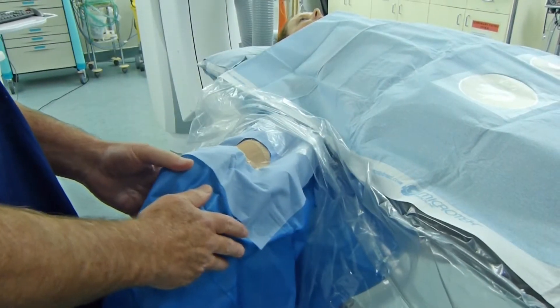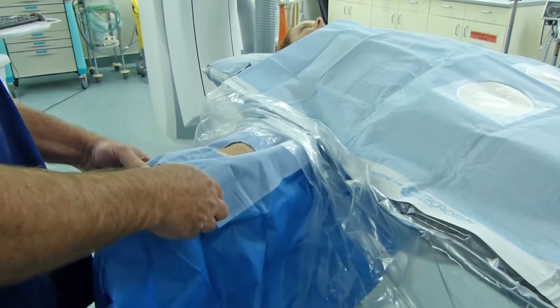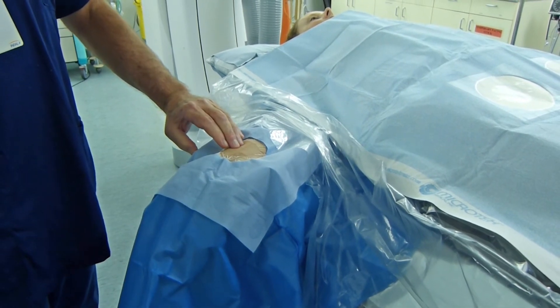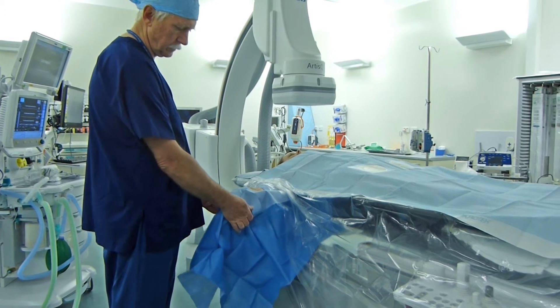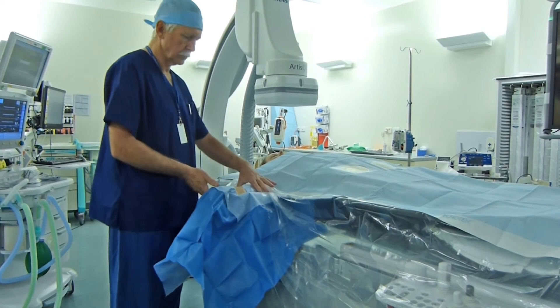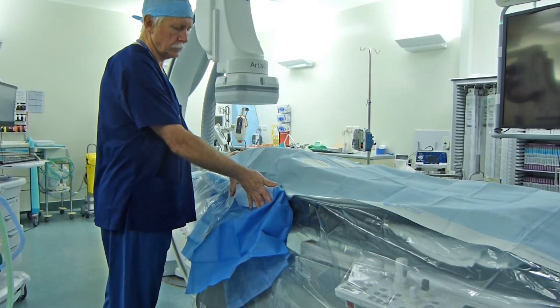For radial artery puncture, once the arm is draped, the handle is then turned laterally and the wrist hyperextended to provide optimum positioning for radial artery puncture. Once radial artery access has been obtained, the hyperextension is removed from the wrist and the handle turned medially, and the forearm is then moved medially to align parallel with the cath lab table.